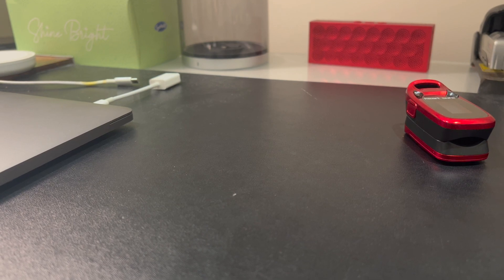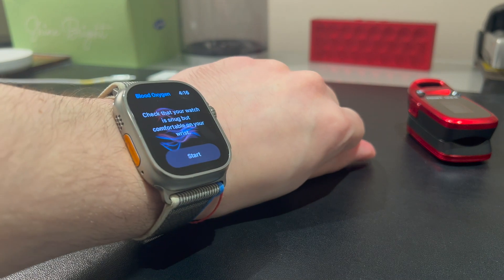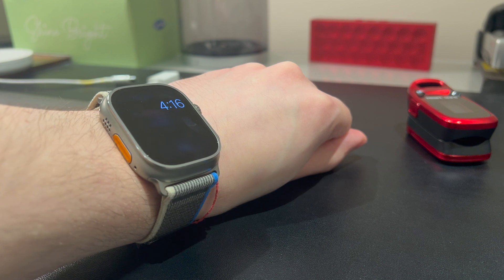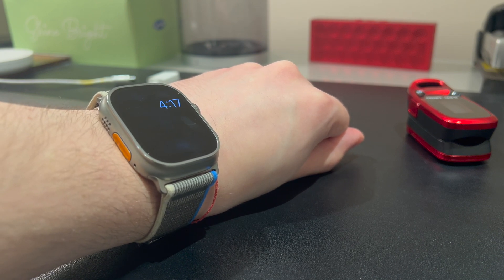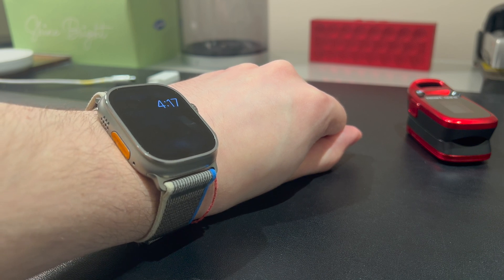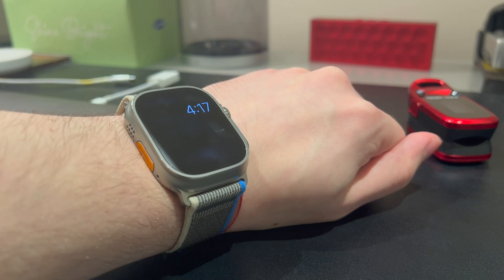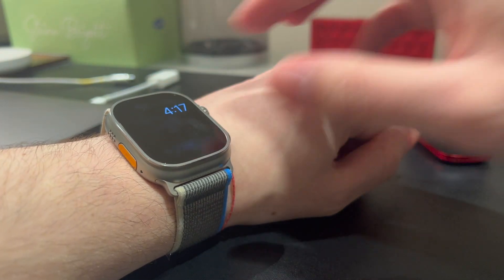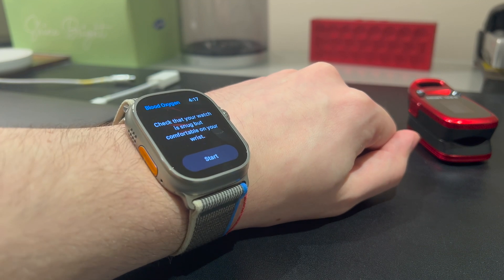Hey guys, so today we're just going to be testing the accuracy of the Apple Watch Ultra's blood oxygen monitor. This is a feature that's been in the Apple Watch series since the Series 6. I know personally when I first had that Series 6, I was having trouble with basically consistently getting a reading. You get the hang of it eventually, and you kind of learn how to make it work properly. Obviously, Apple doesn't advertise this as a medically-grade feature, and it hasn't been clinically tested as the electrocardiogram feature has.